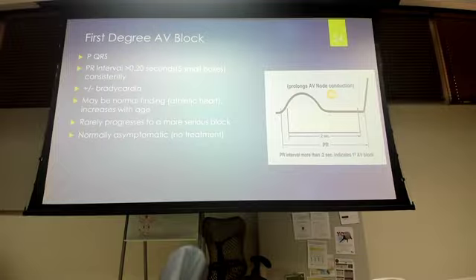Again, it could be a normal finding, but I would tell you for active duty especially, if you find this on an ECG, even if the patient's asymptomatic, it probably warrants a quick cardiology consult. The person's asymptomatic, first degree heart block, this is the first EKG they ever had, and that way they can clear them to make sure they don't identify any underlying cardiac disease.